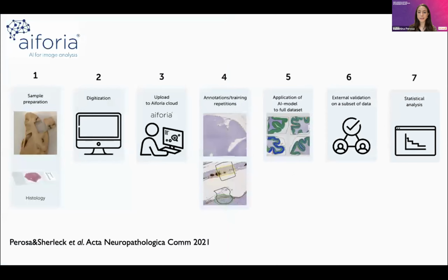So our lab has started to work with Aiforia, and with this tool, we create convolutional neural networks able to identify and quantify histopathological markers of AD and CAA, which have many common markers.